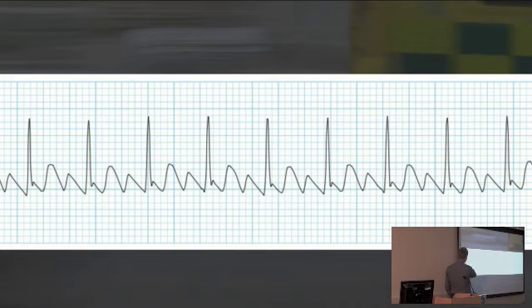So you've got the flutter waves, which go at 300 beats per minute, roughly, all at a consistent rate. You've got the sawtooth pattern, which is just there. And there's one under here, that'll be buried under there. It'll be buried there and there. And what you can see is 1, 2, 3, 4. Every fourth one is conducting. 1, 2, 3. Okay, you've got three there. 1, 2, 3, 3.